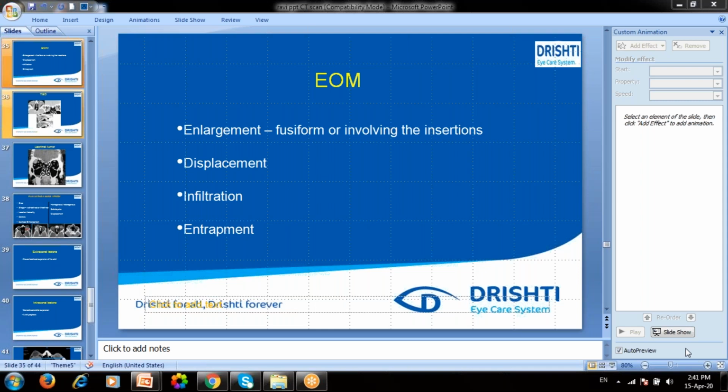If it is a proptosis case, generally you want the posterior surface to be highlighted, right? If you see an eyelid tumor, the anterior-posterior parts have to be highlighted. If it is a fracture case, the bony area has to be highlighted. So if you write the proper area which has to be highlighted, it will not make so much of a difference across the generations of CT scan.